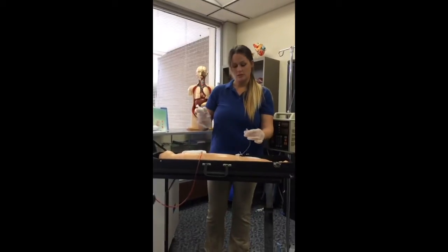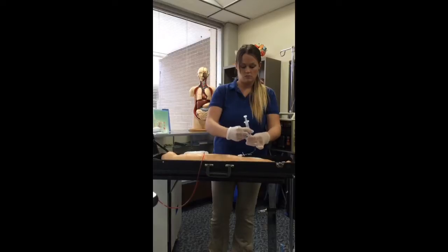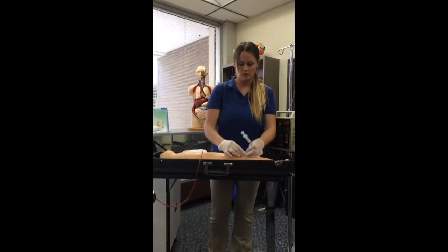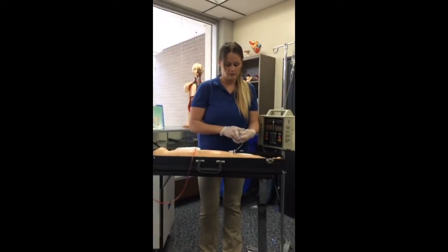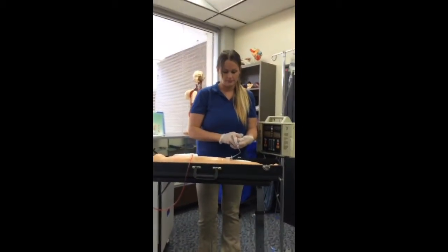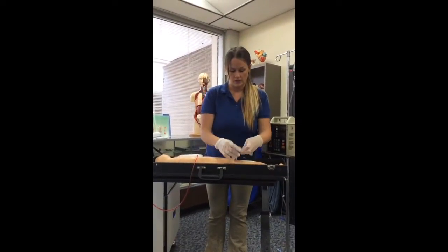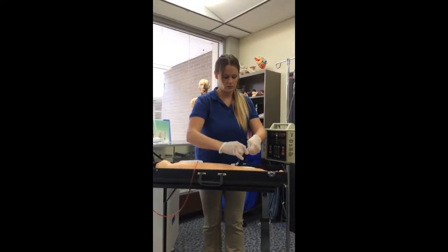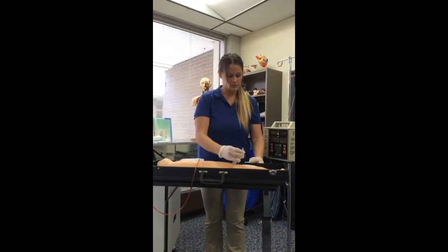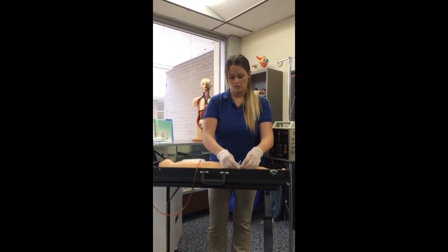I'm going to take my saline flush, unclamp, and then push-stop method, 3 ml of saline. Then I'm going to reclamp it, unhook, and just wipe this off just to be safe. And place it down.